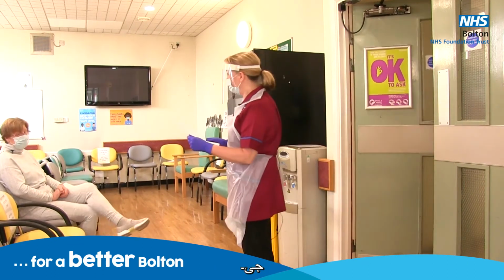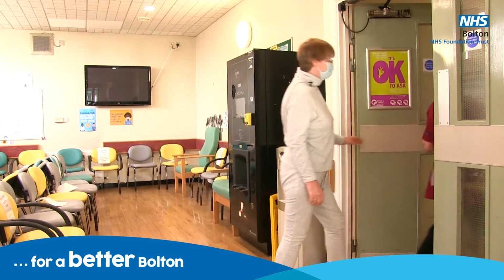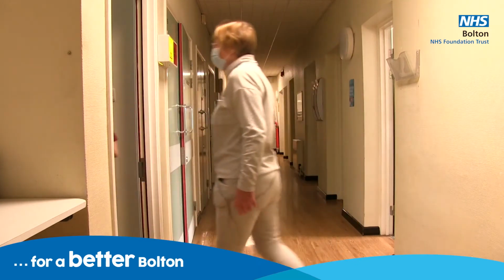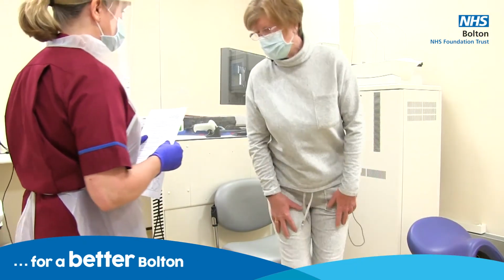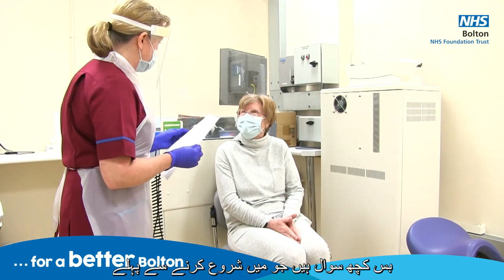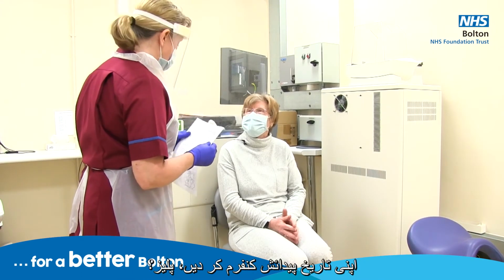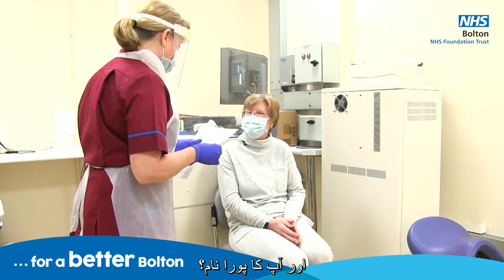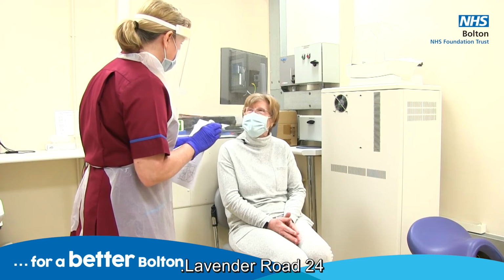Karen Barnes? Want to come with me? Okay, just come through here. Just take a seat there for me. My name's Jane, I'm one of the mammographers here. Just got a few questions I'd like to ask you before we start, just for our records. Could you just confirm your date of birth, please? 29-1-54. And your full name? Karen Barnes. And your address? 24 Lavender Road.